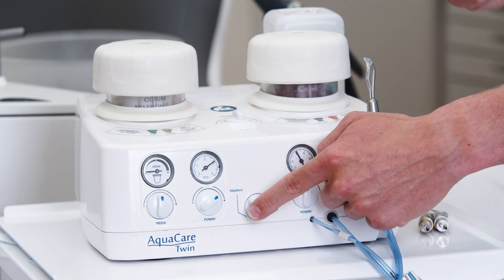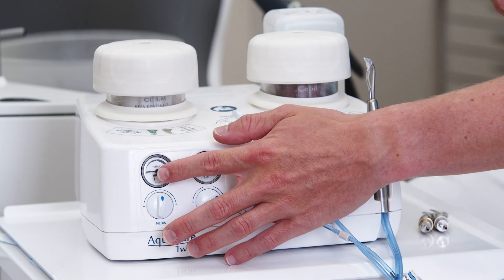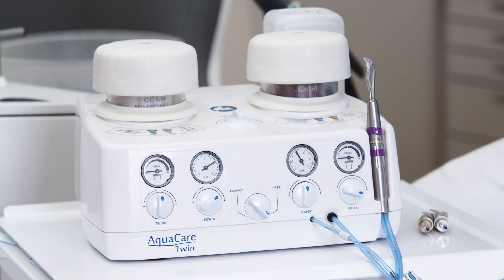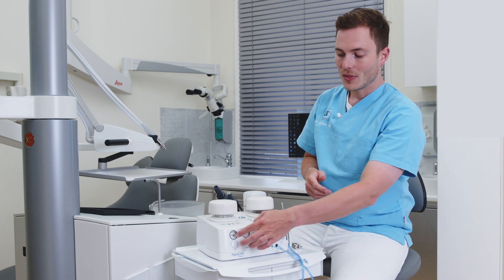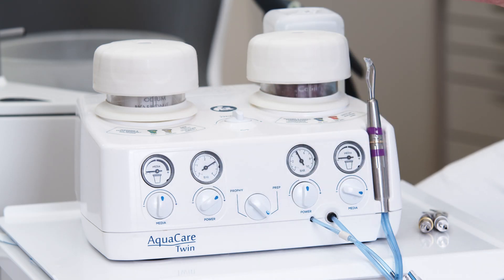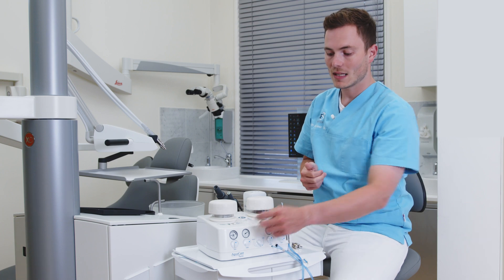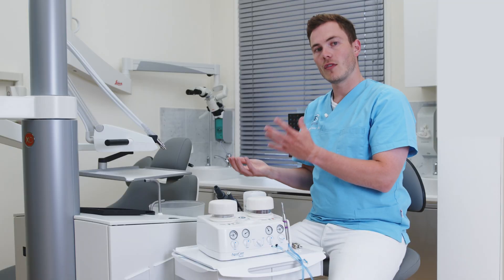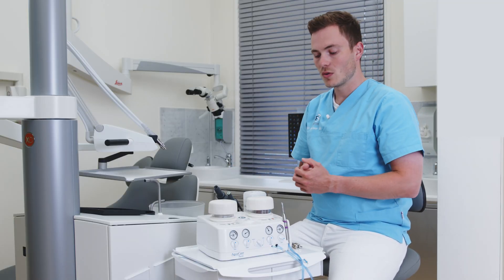Besides the middle switch, I have a lot of other switches on the device. On the left side I have a switch that controls how much powder I will get — currently in a 12 o'clock position. On the right side I have the amount of bar, so the pressure of the device, and I can easily change the switch to change either the volume of the powder or the pressure used by the device.